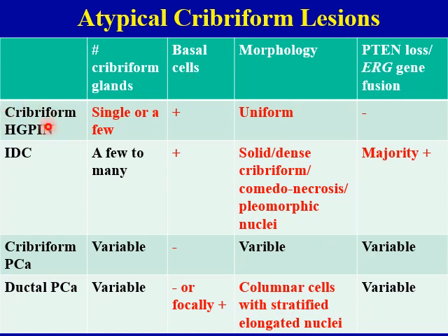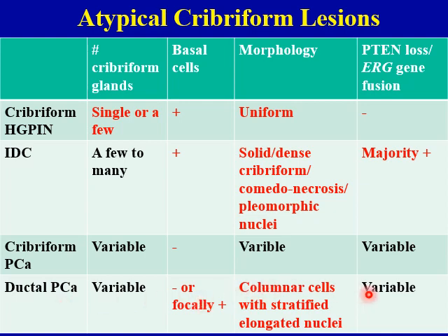In cribriform high-grade PIN, you typically see one or few atypical cribriform glands; basal cells are present, nuclei are uniform, and you don't see PTEN loss or ERG gene fusion. In intraductal carcinoma, basal cells are present, and you will see one of these features: solid or dense cribriform architecture, comedo-necrosis, or pleomorphic nuclei. The majority of IDC glands have PTEN loss and ERG gene fusion. In cribriform carcinoma, basal cells are absent. In ductal carcinoma, the cancer glands are composed of columnar-shaped cells with stratified elongated nuclei; basal cells are usually negative but can be focally positive in some cases.